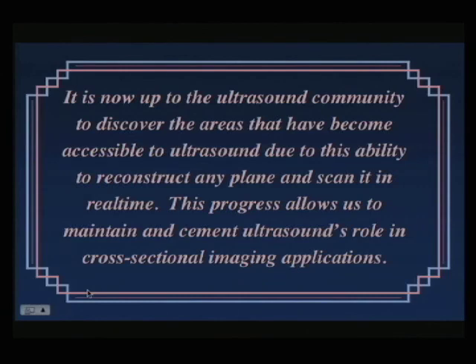So it's really now up to us in the ultrasound community to discover the areas that have become accessible to ultrasound, because now we're able to reconstruct any plane and even scan it in real time. This progress allows us to maintain and cement ultrasound's role in the cross-sectional imaging arena.